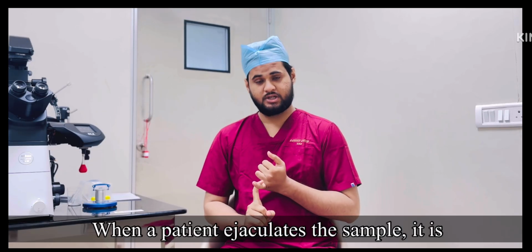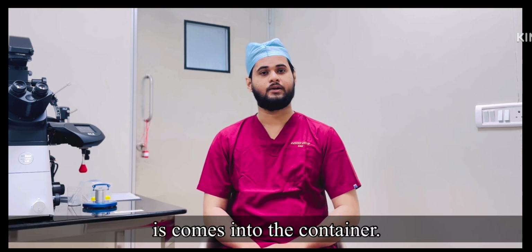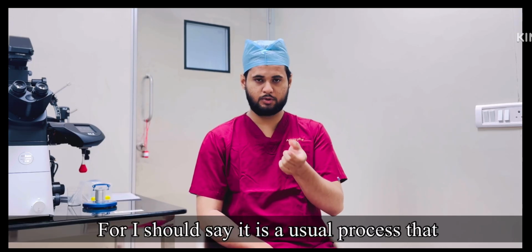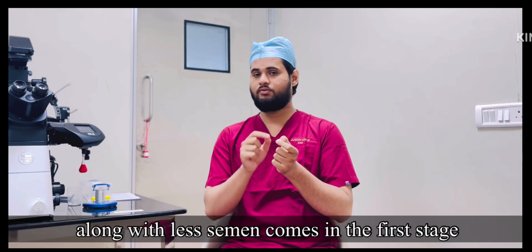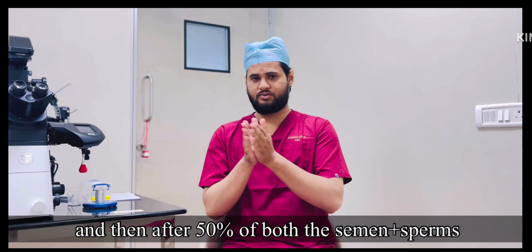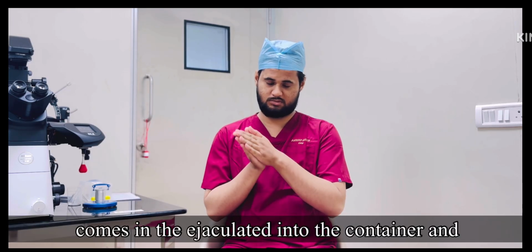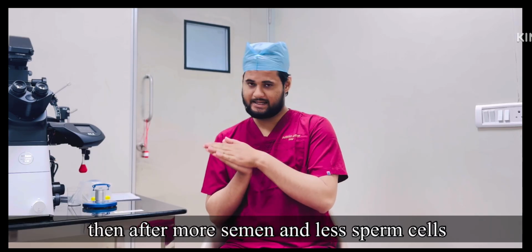When a patient ejaculates the sample, it is not a uniform mixture of semen and sperm that comes into the container. It is a usual process that the concentrated form of sperm along with less semen comes first, then about 50% of both semen and sperm, and then more semen and fewer sperm cells.